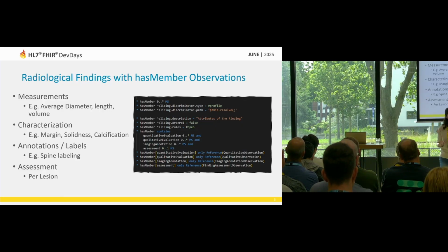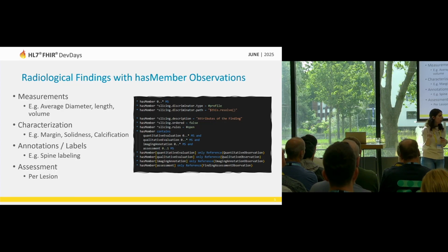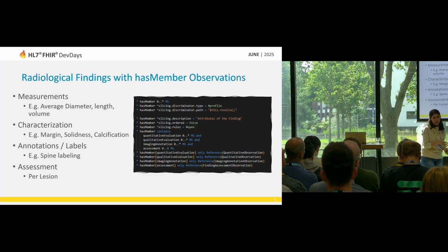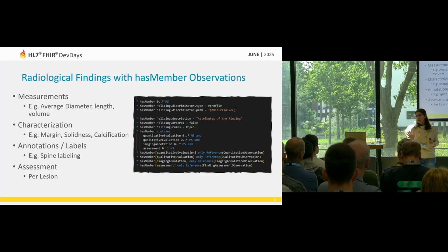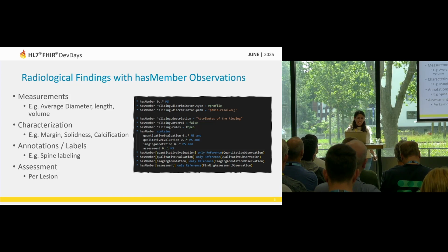You need, for example, to state which method was used for each of the density values that you are using, if it is the minimum or the maximum. Therefore, it is really better, from day one that you are doing your FHIR profile, to go directly to the hasMember. So this is like my cooking recipe, and I'm sharing my cooking secrets with you.